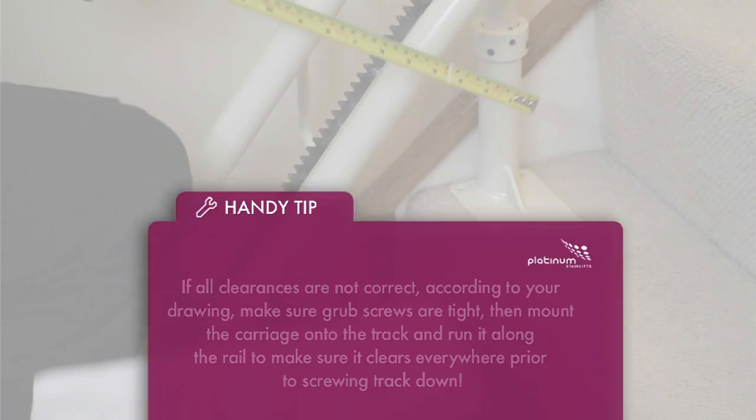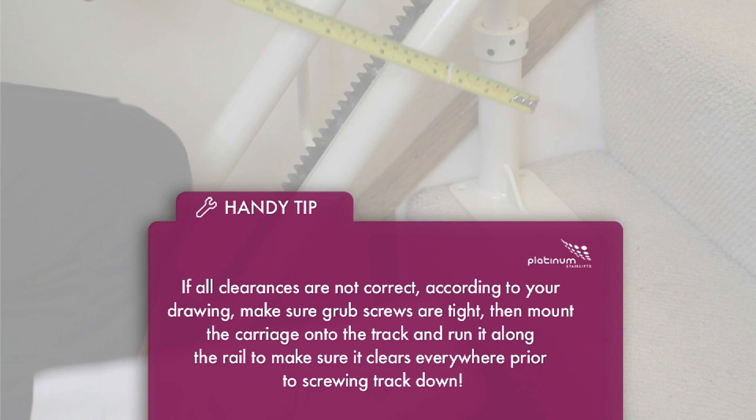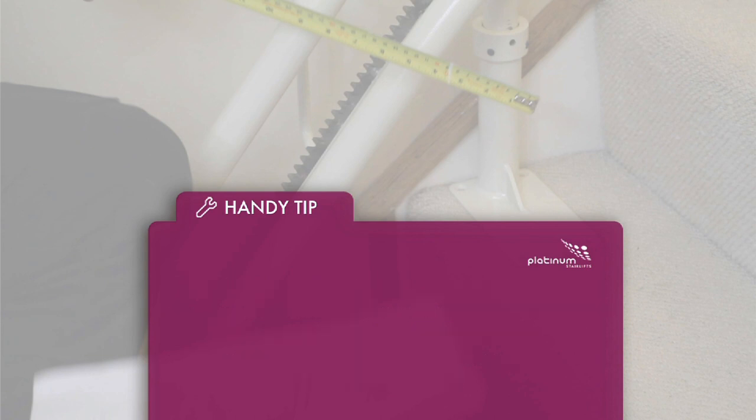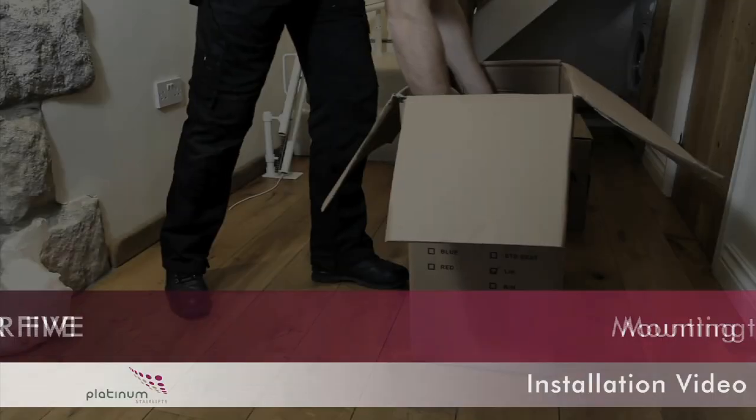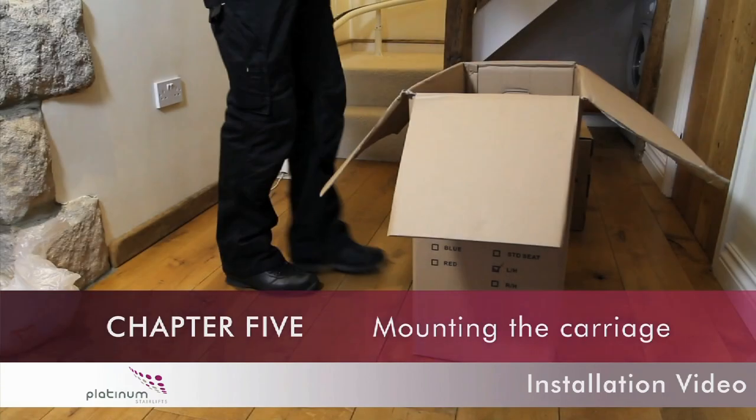Handy tip: If all the clearances are not correct according to your drawing, make sure the grub screws are tight, then mount the carriage onto the track and run it along the rail to make sure that it clears everywhere prior to screwing the track down.